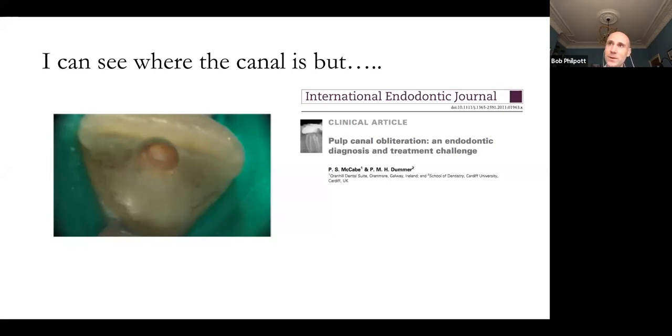They're slightly different. So in practice, all of the endodontic instruments are on the left side, so I don't have any of them on my bracket table. Whereas in the hospital, all the instruments I need are on the bracket table on my right side. So it's just those subtle differences. Both systems work well for me.